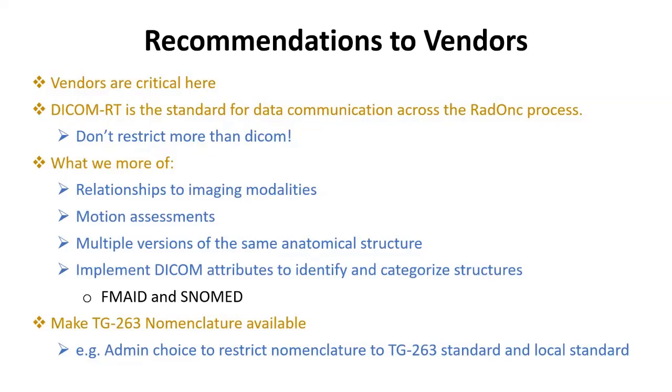I would also like to mention that there are some departments who took this a further step. They even standardize the name of the plan, the name of the course, the name of the QA, the name of the structure set itself. Because now if you create a structure set for a prostate, there's terminology for that structure set. The naming of the fusion imaging, whatever modality you have, PET or MRI or another CT, post-op or whatever, they also implemented this. They have even standardized the name of the fields. We have this in our department too: a standard naming for the fields, the plans and so on. But there are centers that put in a protocol: this is a VMAT plan, this is how you name it; if this is an IMRT, this is how you name it; if this is a 3D conformal, this is how we name it; electron and so on. And this is really a brilliant way to make standardization for everything from A to Z, from the course that you create up to when the patient finishes the treatment.